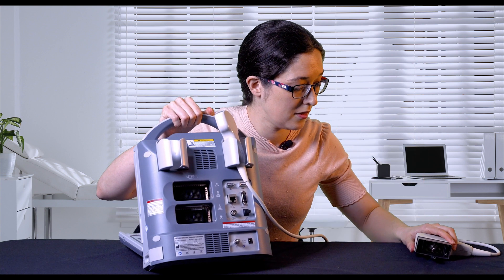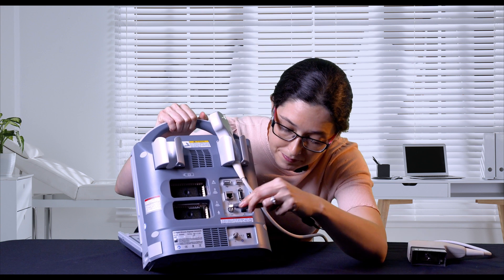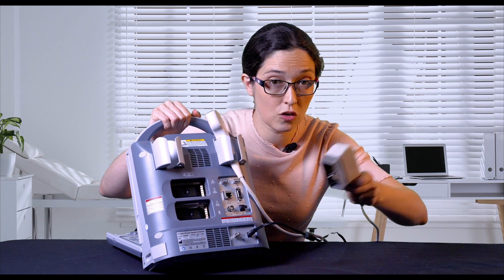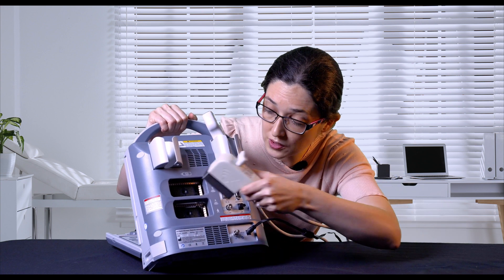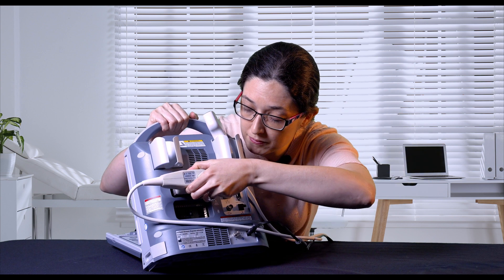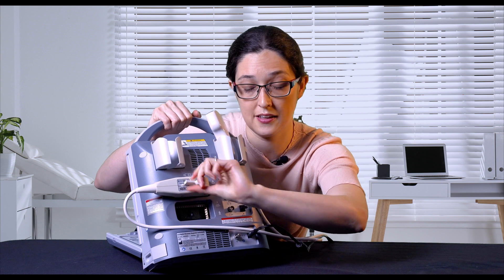To get started, plug the power cable into the back of the machine. Orientate your transducer according to the diagram on the back of the system and secure it by twisting like this.